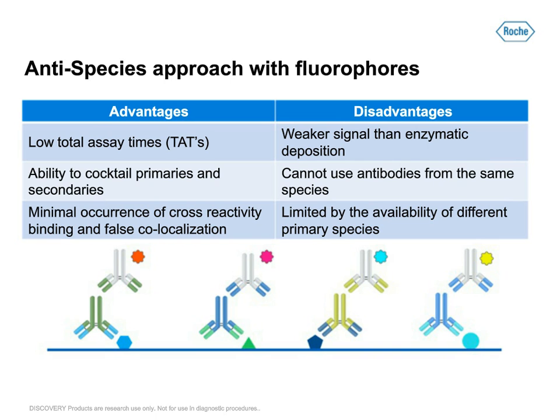What you can do as well, since these are enzymatically deposited with HRP, is quench HRP just by using discovery inhibitor, which is a 3% hydrogen peroxide solution, which will quench any active HRP on the slide. You could also use other low pH solutions or even high salt solutions to affect the affinity of those primaries and get them off the slide so you can wash them.